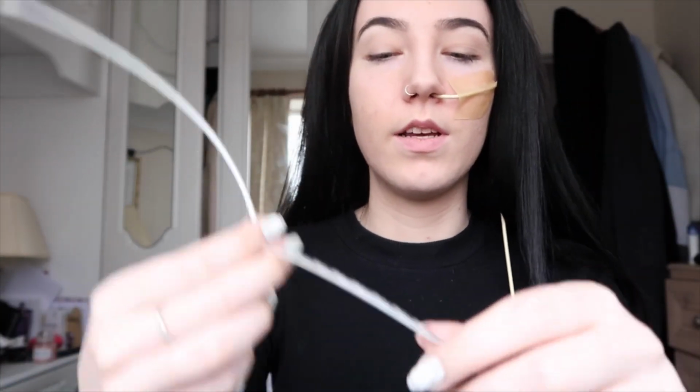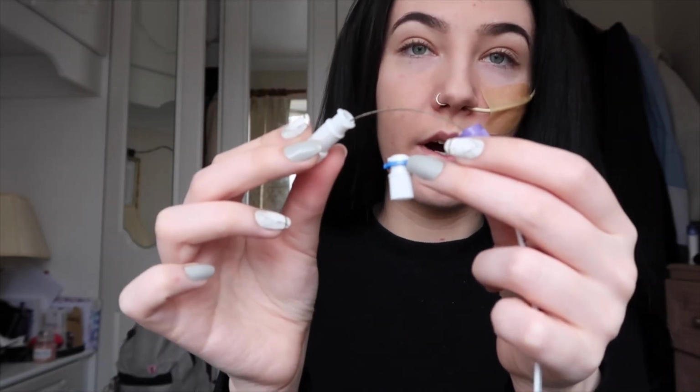Right. So you can use a bit of lubricant, but I got told not to, and actually just dip it in a little bit of water before you start inserting it. So now I'm going to just take the tube out itself. It looks like this. Make sure your hands are clean. You can wear gloves. I'm not going to. So it looks like this, and this thing here, I'm just going to unscrew it, like that. That is the guide wire, and that just makes the tube stiff, so it's easier to place.